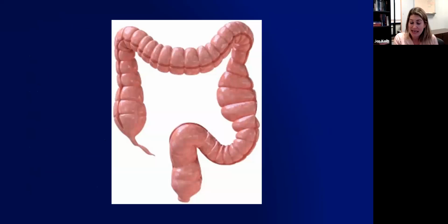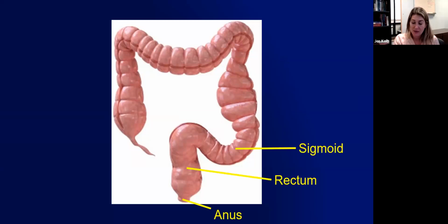So let's do some anatomy review. This is a colon. If you imagine a person standing in front of you, this is how things would lay. Starting from the bottom, we'll work our way up. The anus leads into the rectum, going up. And again, this is the way the scope moves; it moves up and around. Then we go into the sigmoid colon, and the descending colon.